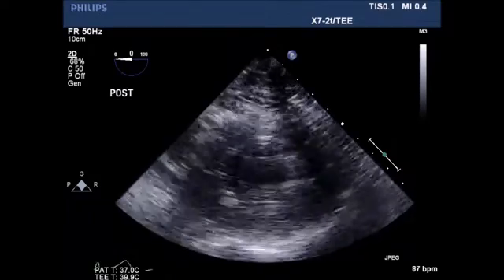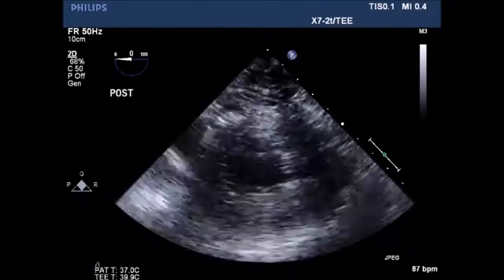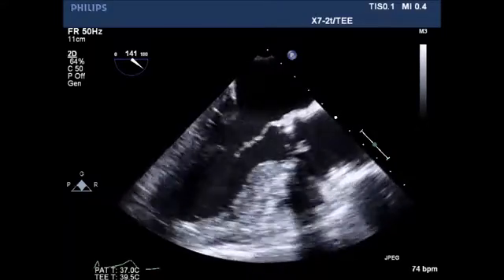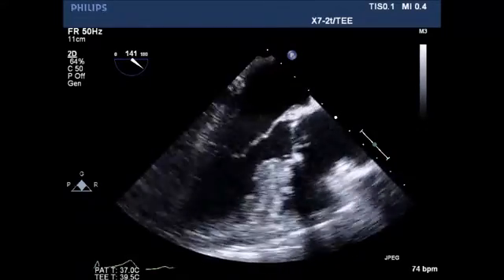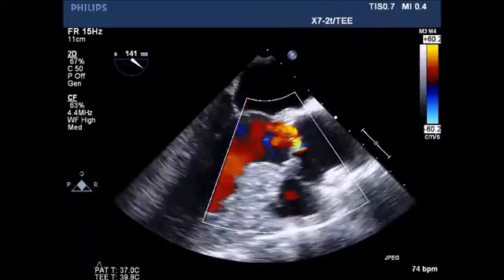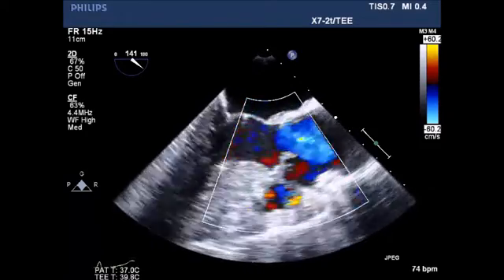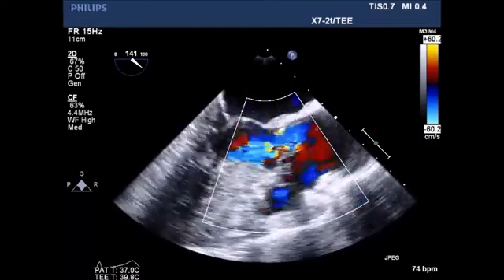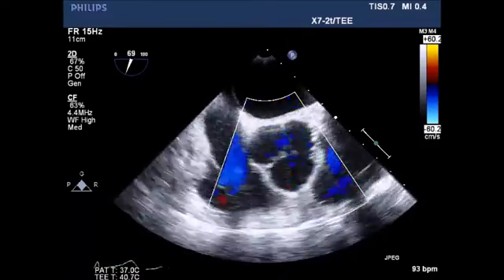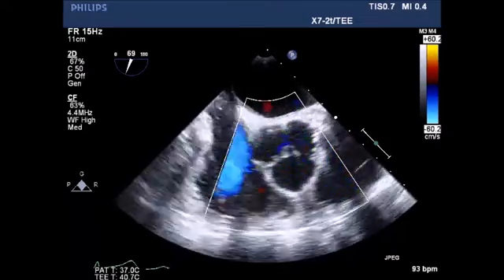The patient underwent successful coronary artery bypass grafting and patch closure of the ventricular septal defect. Post-pump long axis view of the left ventricular outflow tract shows no residual color flow through the repair site, with aortic insufficiency unchanged compared to preoperatively.